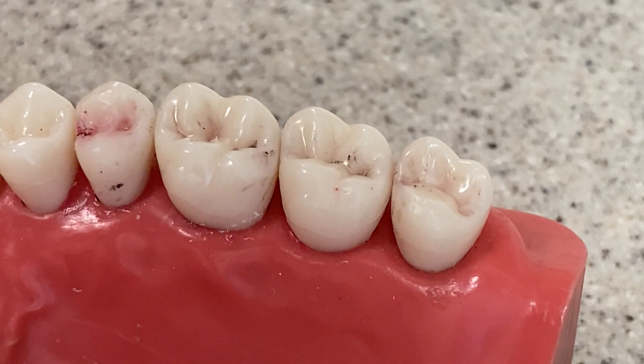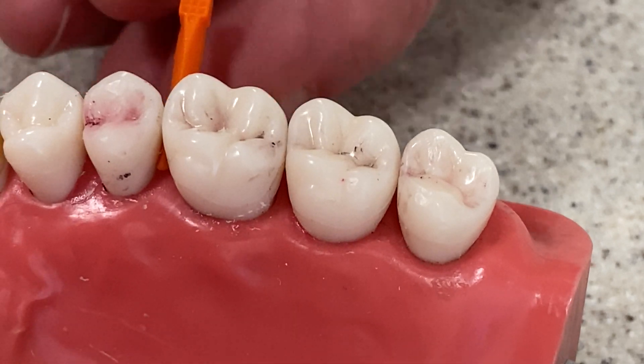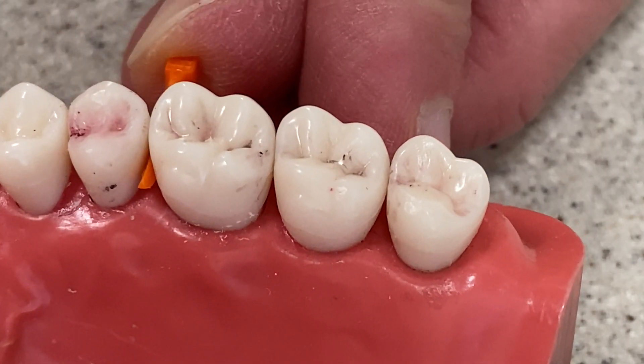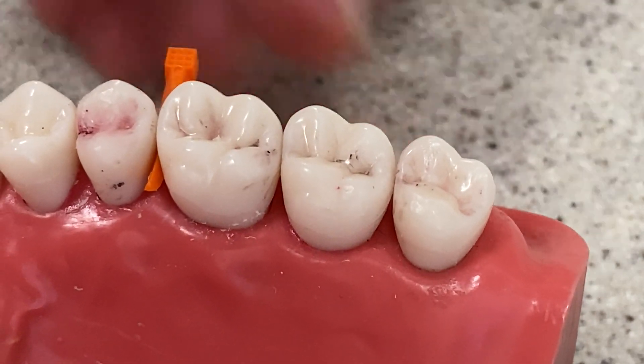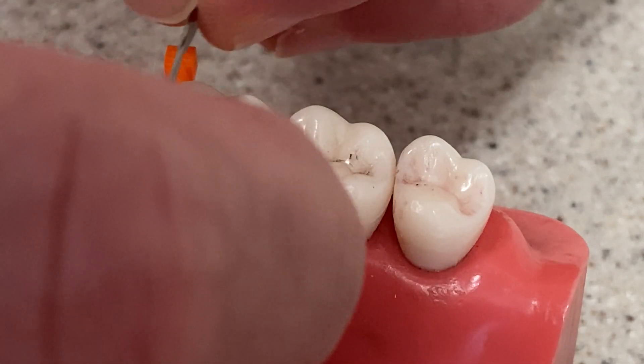What you want to do in order to protect the adjacent teeth is make sure there's some sort of a physical barrier. Say you're doing an MO here on 14. The first thing you want to do is pre-wedge. So you get a wedge, preferably a larger one, and just kind of push it in. You're going to want to use an instrument in practice. When you're doing tabletop or any kind of preclinical thing you can use your fingers, but that's not exactly the smart thing.